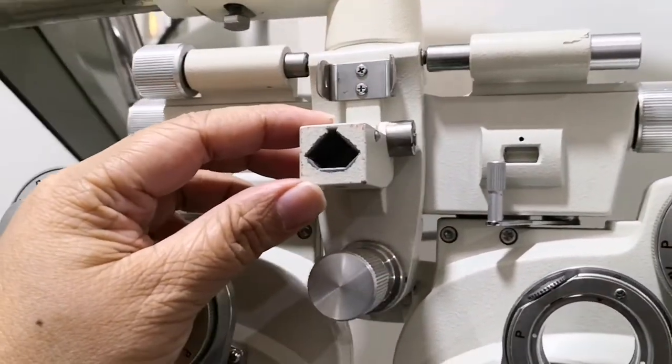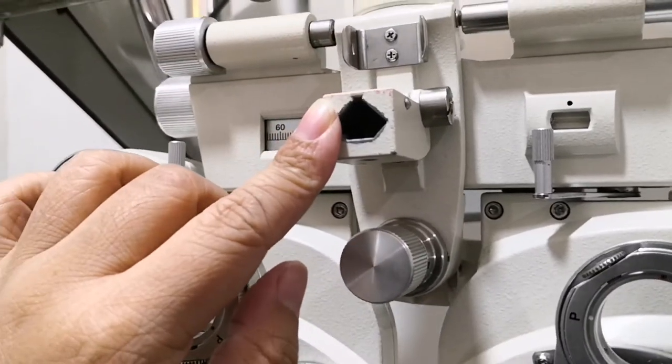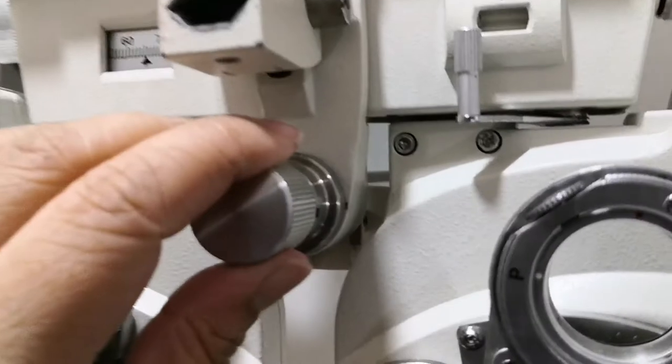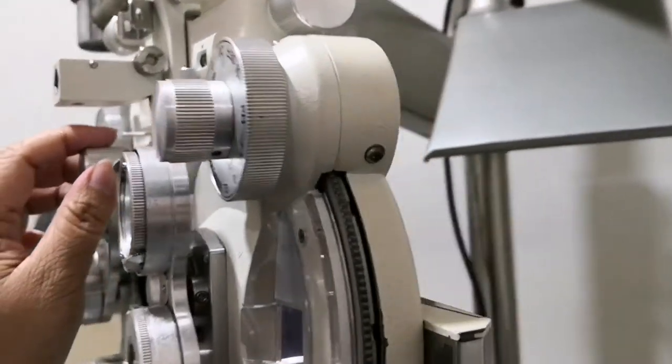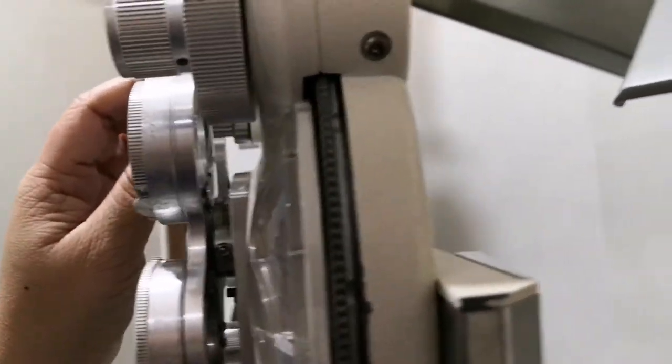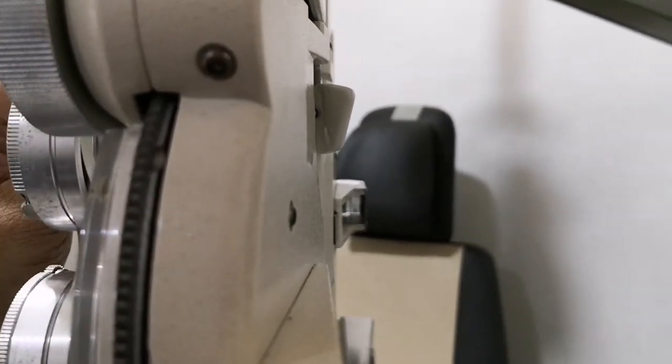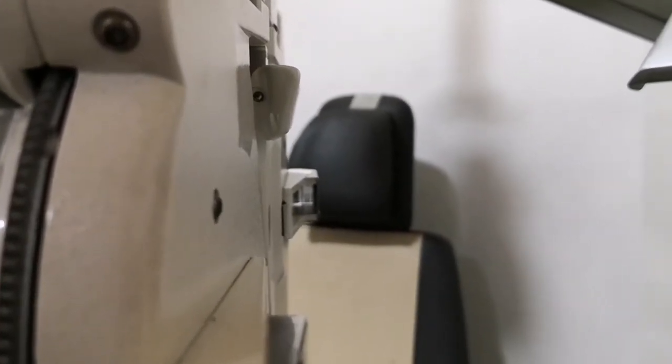This is the reading rod holder. And we also have the adjustment for the forehead rest. If you need to move it forward, you just have to rotate it. And if you want to move it backward, just rotate the knob.